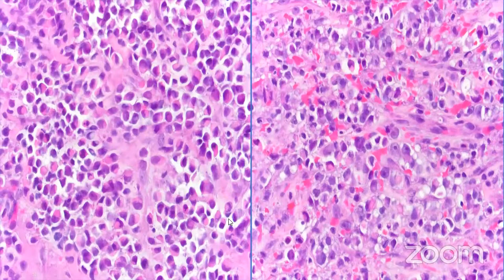This is a closer look at the tumor cells. They could be coming to differential of lymphomas, small cell carcinomas, and even germ cell tumors. But this kind of eccentric nuclei and this plasmacytic look is characteristic for alveolar rhabdomyosarcoma.